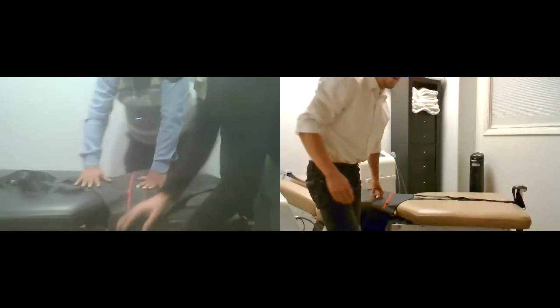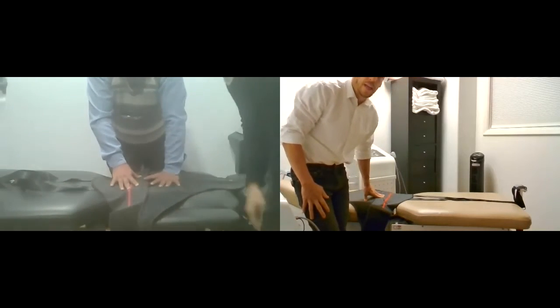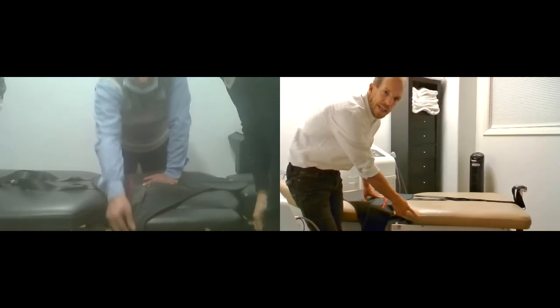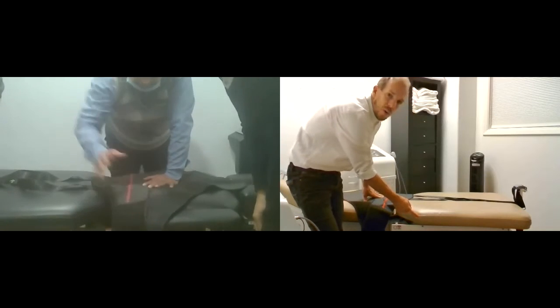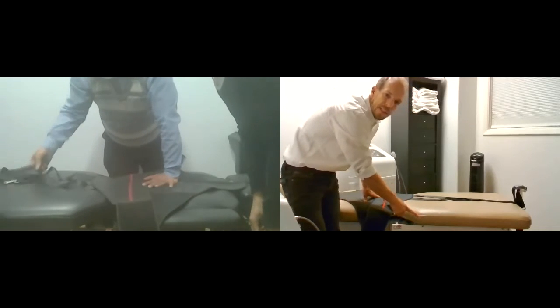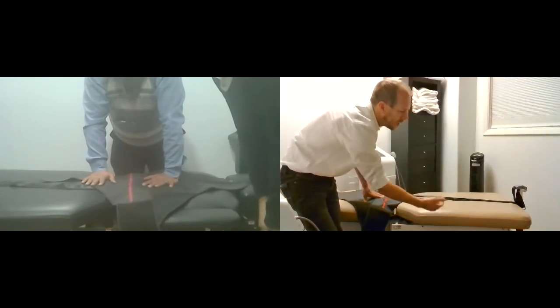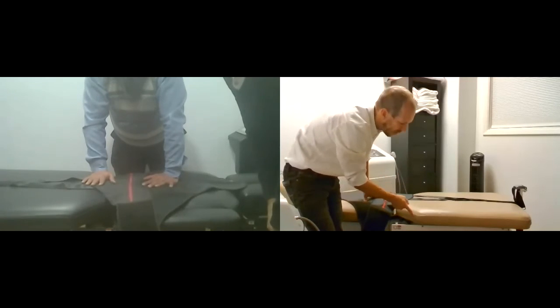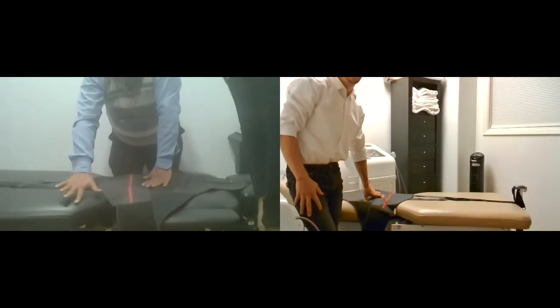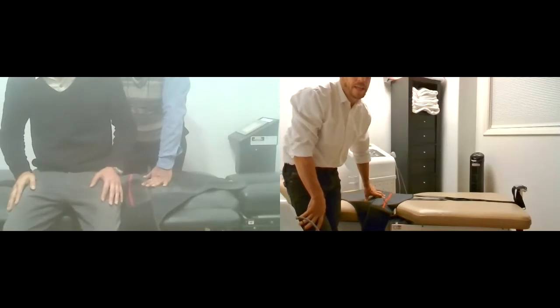Now what you want to do is hold it with your left hand, and then with your right hand, point to where you want the patient to sit, which is going to be right at this corner here. Right where the table starts to go in is where you want them to sit. If they sit too low on the table, then when they go to lay back, you have to scoot them way up. So about right here is where you want them to sit. Now go ahead and have him lay back.